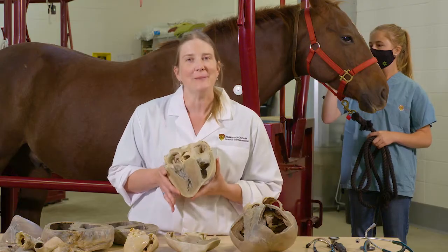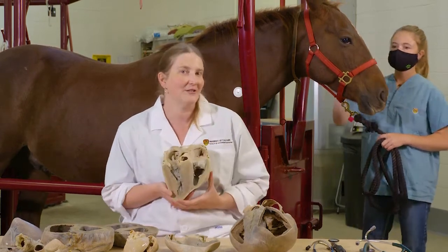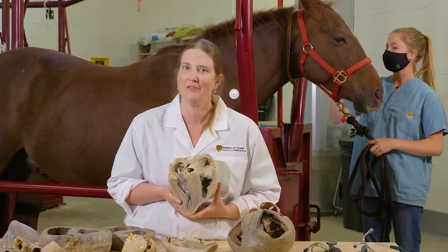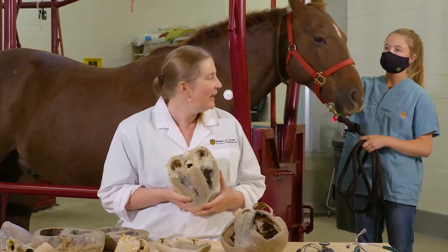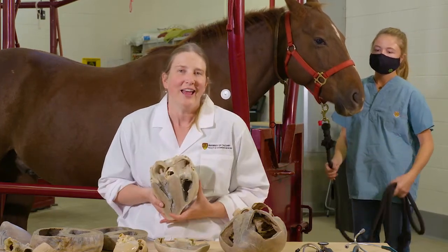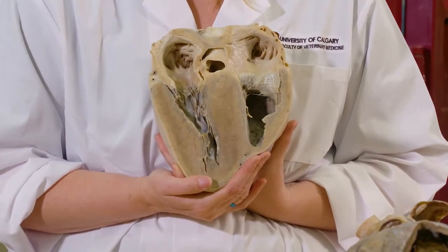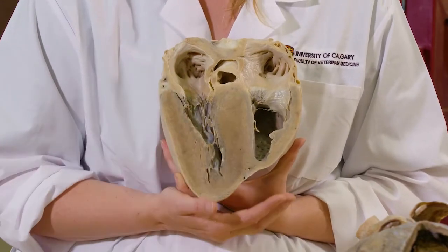I want you to pay special attention because of our horse Daryl here — you've seen him in the background. Daryl is one of our teaching horses here at the university, and we have a wonderful herd of teaching horses that help us teach our students. Daryl actually has an issue with his heart, so I'm going to draw your attention to this part of the heart. We're going to come back to this as we go along with our ultrasound of Daryl's heart.